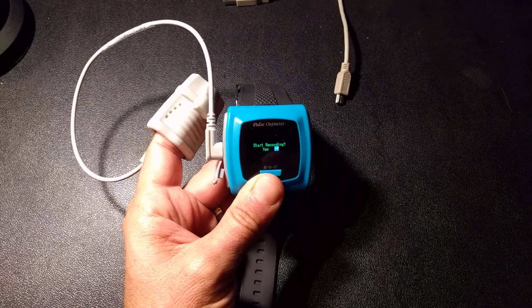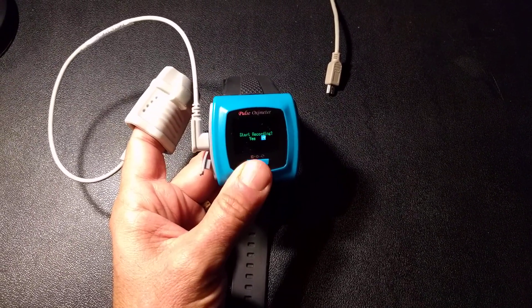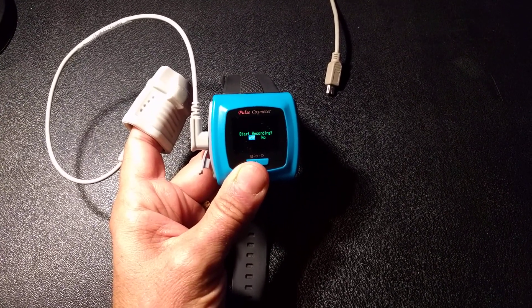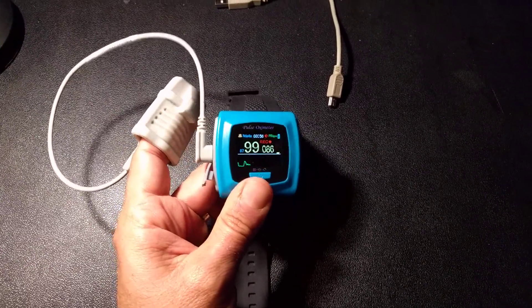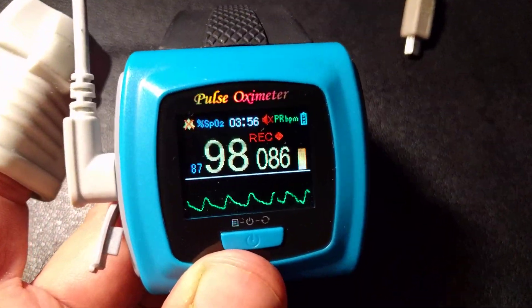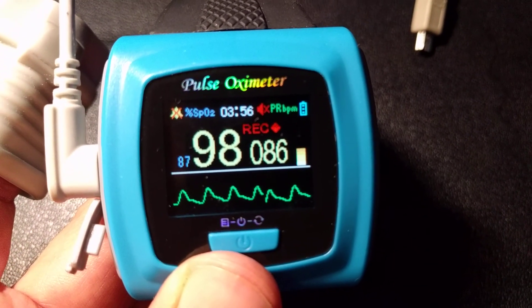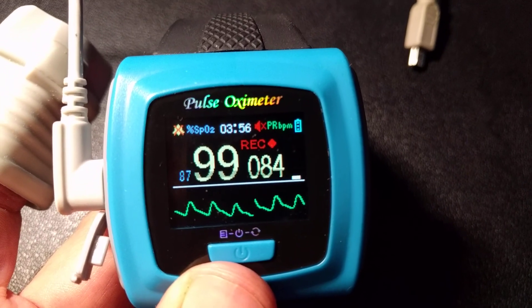When you go to sleep, turn it on. Short press to toggle, then long press to turn on the recorder. It goes into recording mode and you see the recording light — it's red. It says record and it's got the light flashing. If you don't see that before you go to sleep, it's not working. Make sure it's recording your data.